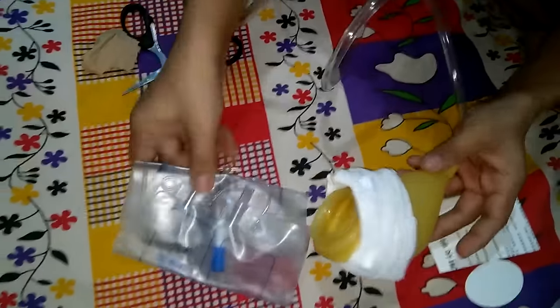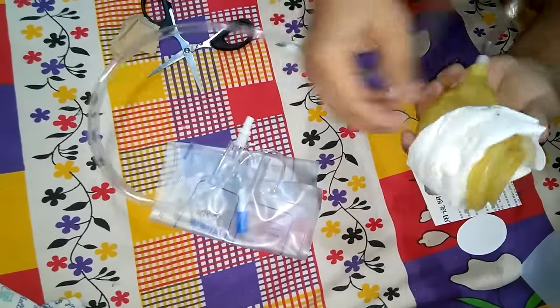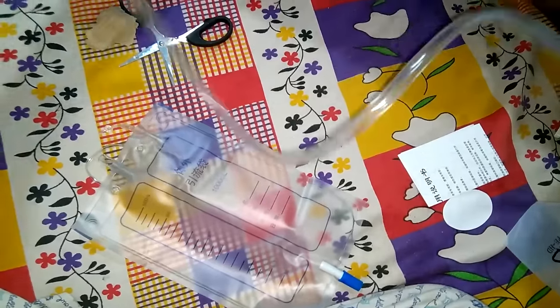So this is the setup — this is the bag they have provided. Simple setup, simple bag. Let me just open it up.